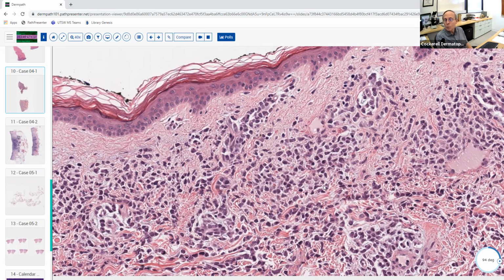This is leukemia cutis. Now, why does it look a little like carcinoma? What does that tell you about the differentiation of leukemia? Leukemia cells should be discohesive, and the carcinoma in theory should be more cohesive looking. The cells here are kind of discohesive. They have more abundant cytoplasm, look quasi-epithelioid, and form these cords and strands.